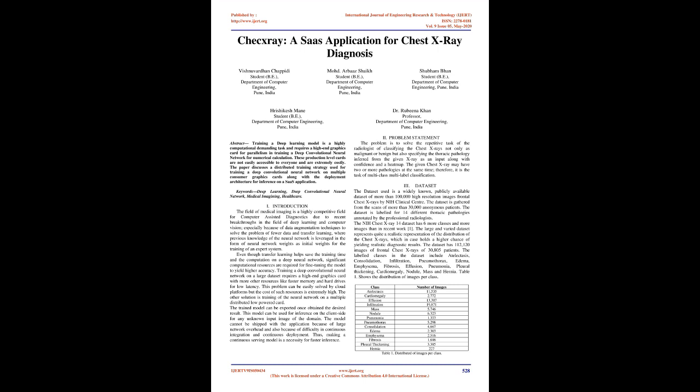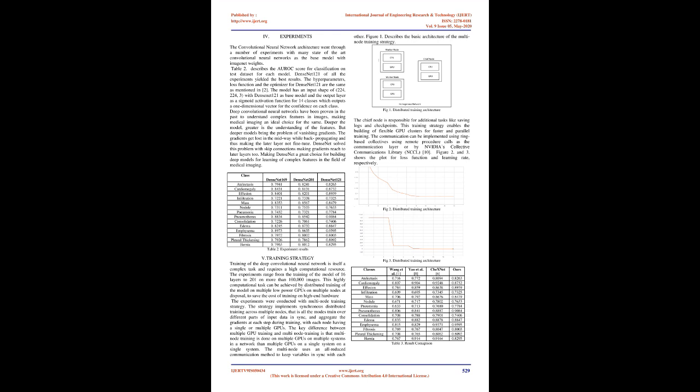2. Problem statement. The problem is to solve the repetitive task of the radiologist of classifying the chest X-rays not only as malignant or benign but also specifying the thoracic pathology inferred from the given X-ray as an input, along with confidence and a heat map. The given chest X-ray may have two or more pathologies at the same time. Therefore, it is the task of multi-class multi-label classification.